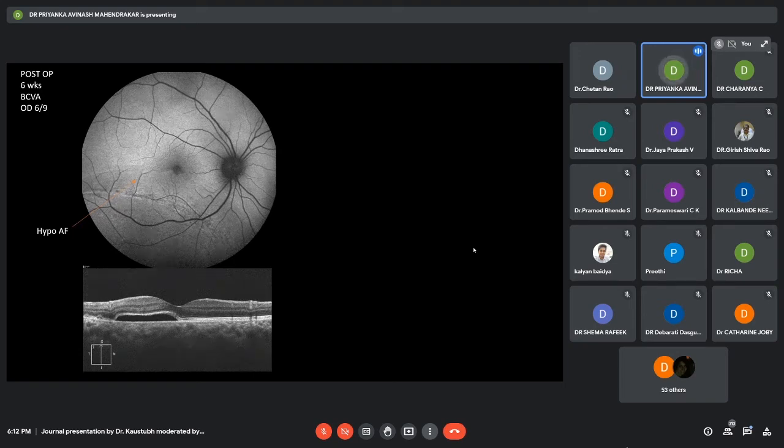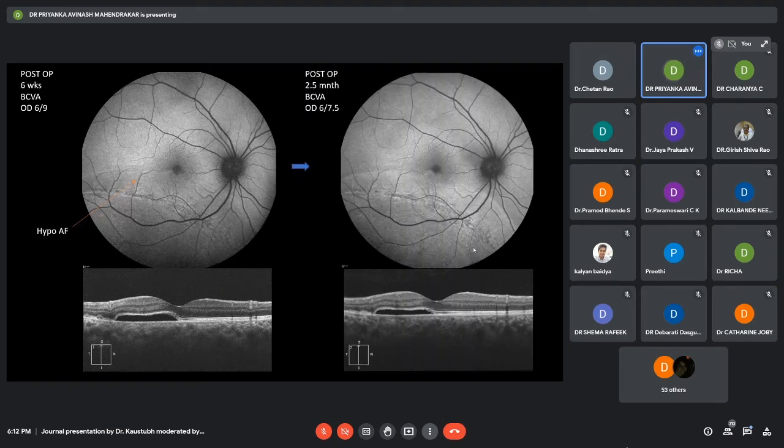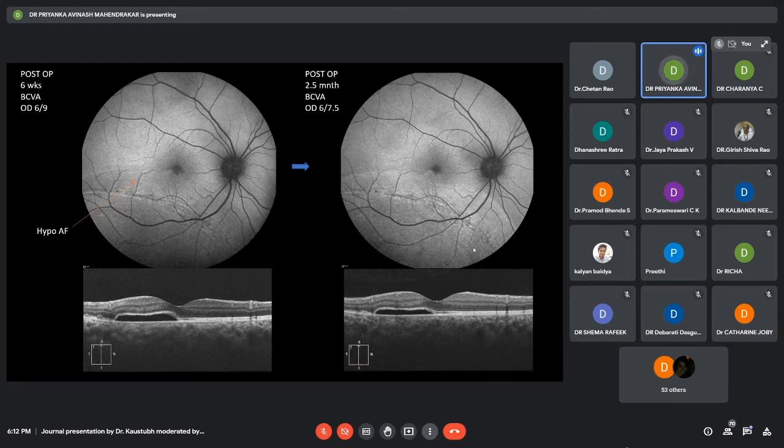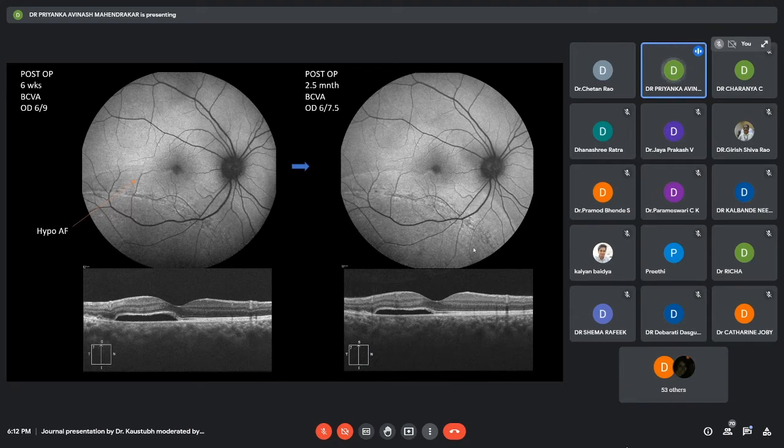This again, at postop two and a half months, this hypo-autofluorescent patch turned into hyper-autofluorescence. The only difference in the OCT is that the height of the SRF is decreased.